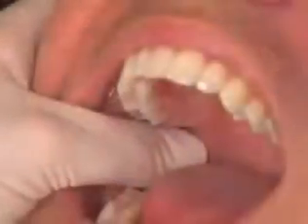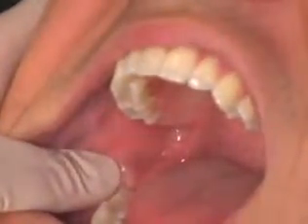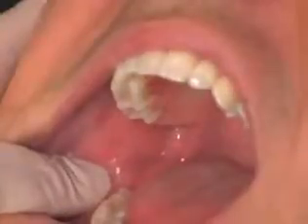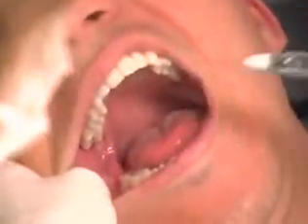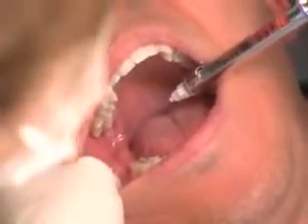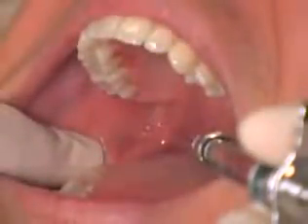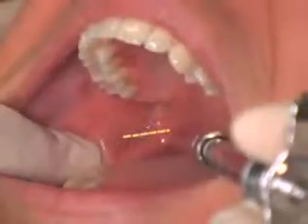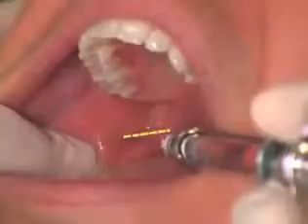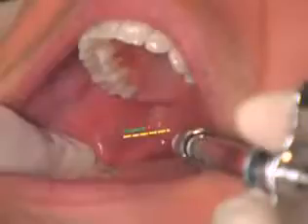A finger is placed on the lingual aspect of the ramus and pulled anteriorly until the coronoid notch is palpated. The coronoid notch is the greatest concavity on the anterior border of the ramus. The barrel of the syringe is placed in the corner of the mouth on the opposite side. The needle tip touches the most posterior aspect of the pterygomandibular raphe. The needle tip is then moved half the distance toward the coronoid notch and then half the distance back toward the raphe. This locates the injection site, which is 3/4 of the distance from the coronoid notch to the raphe.